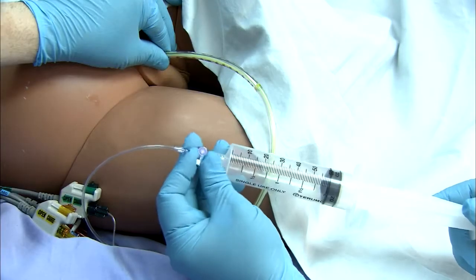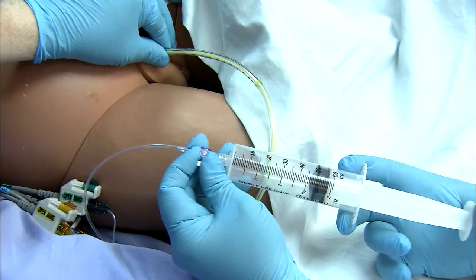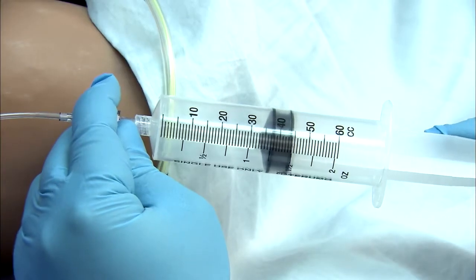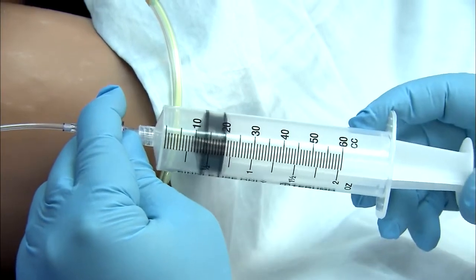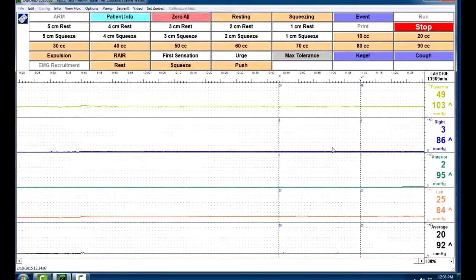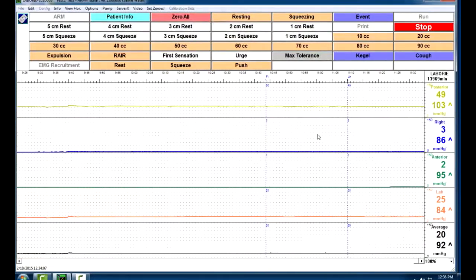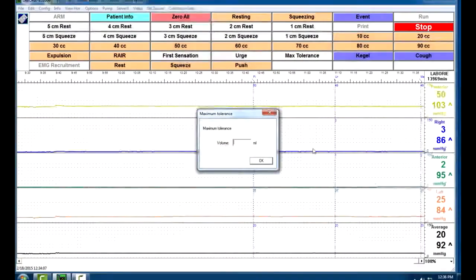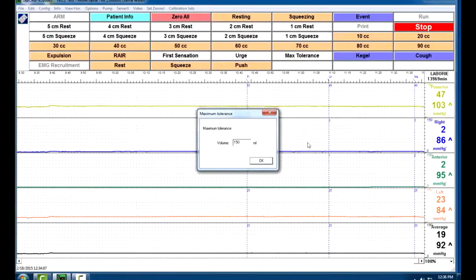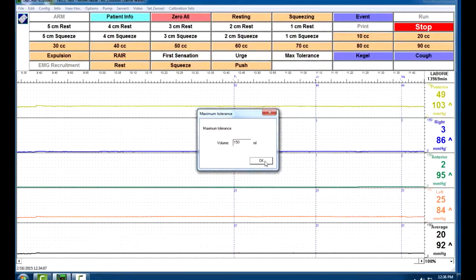We keep filling the balloon and we keep injecting the air into the balloon using the same procedure of using the stopcock to fill your syringe again until they tell you they have their maximum tolerance, that they feel they can just hold no more. Record what that volume is. Let's say it's 150 cc's. We'll go ahead and click max tolerance, enter the value 150, then click OK. At this point, we're essentially done.